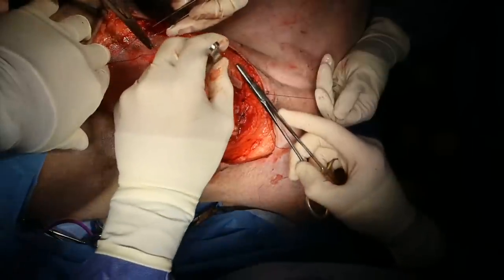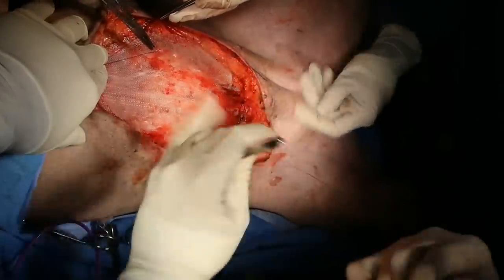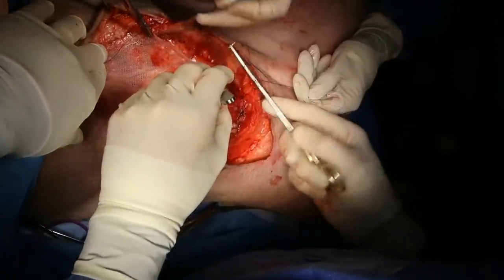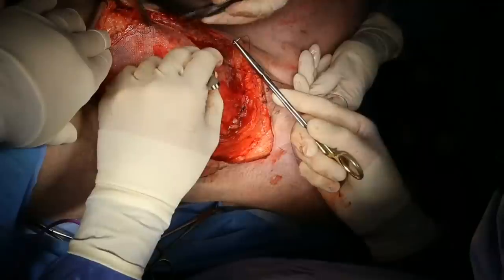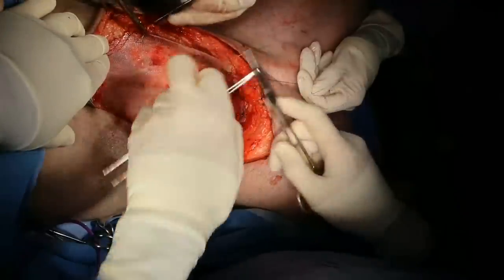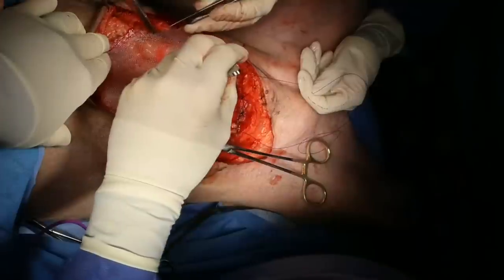Yuri, I think I'm just going to close that fascia like that, rather than going right down. So what you're doing is fine. I think we're probably doing the same thing anyway. I was grabbing the deep margin as well, like I was grabbing body wall down here as well, but I cannot do that anymore. Yeah, I think that because there's no pocket there. Yep. There's no communication with the abdomen. Yeah. I might trim out a little bit more.